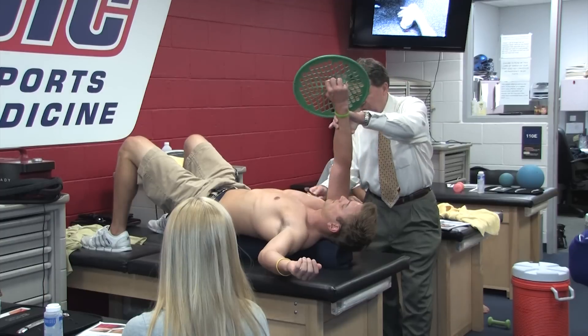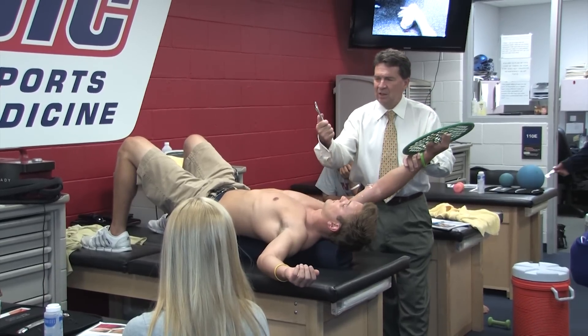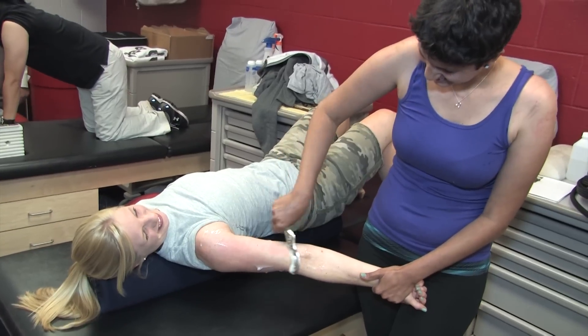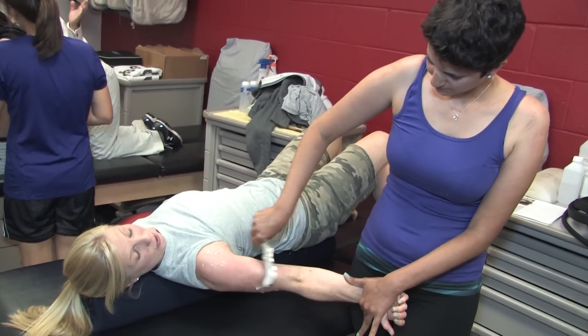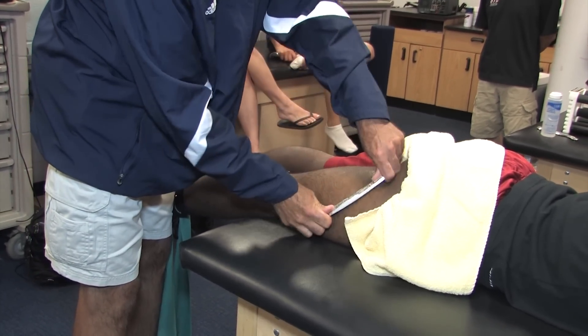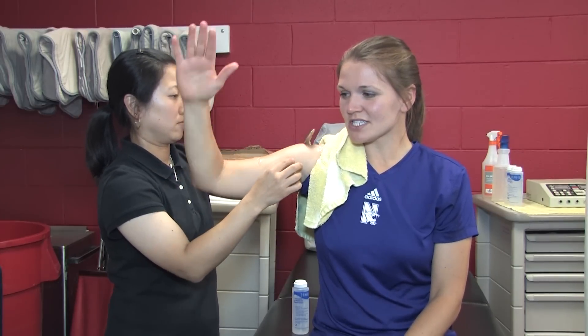Come through and you will see this fits right around his peck nicely. This end and this bump — I can come right around to the side. I can feel the grittiness too. So you are in a comfortable position. Does that mean you contract? I can feel more when I contract.